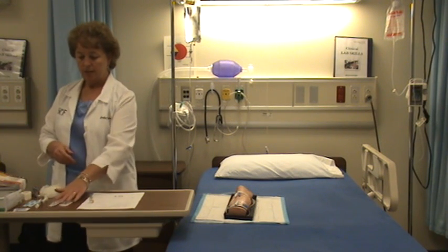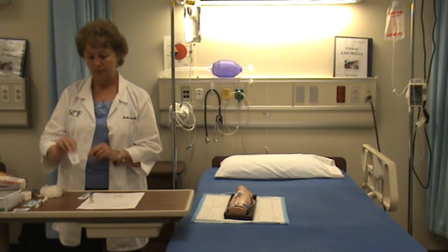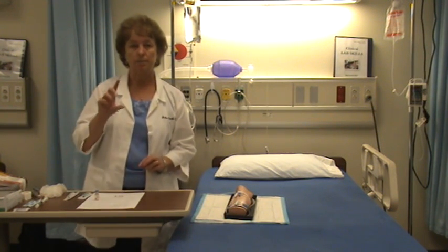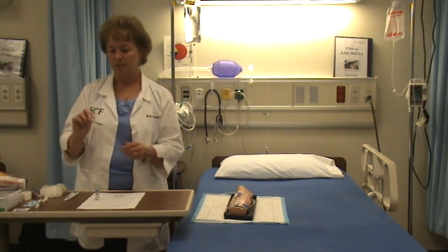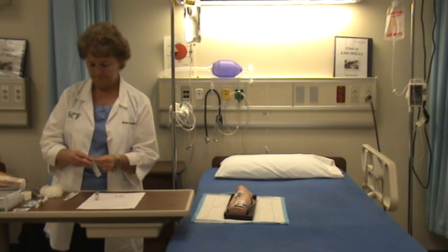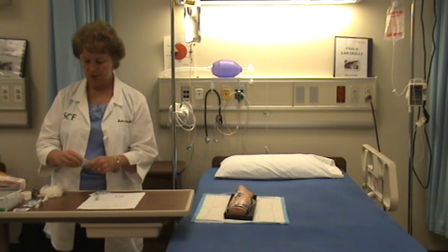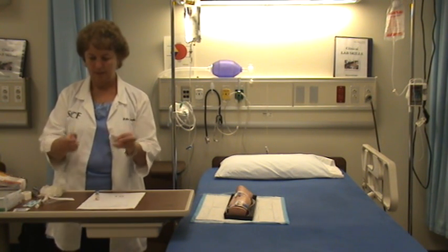I'm going to get the supplies I need to draw up the medication. I've got a three milliliter syringe because I only need two milliliters — it's best to draw up in the smallest syringe I can use. I also have a 22 gauge one inch needle. I open that up, place the needle on the syringe, keeping the tip sterile.